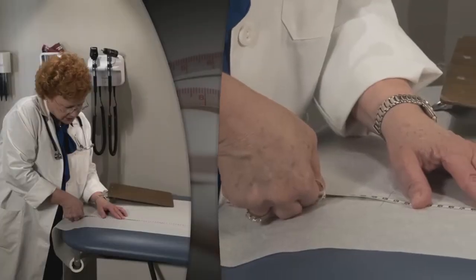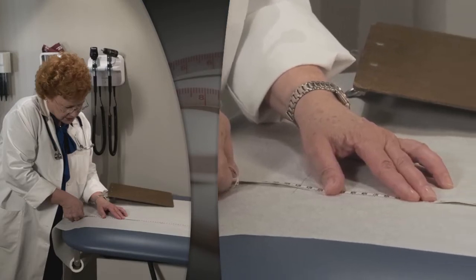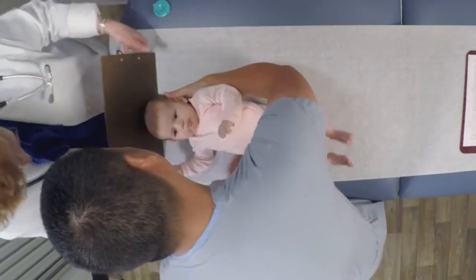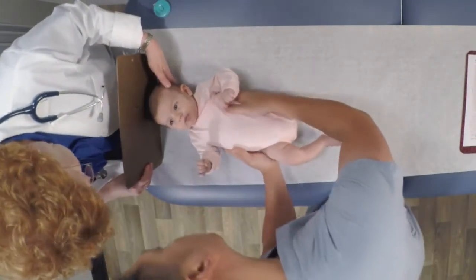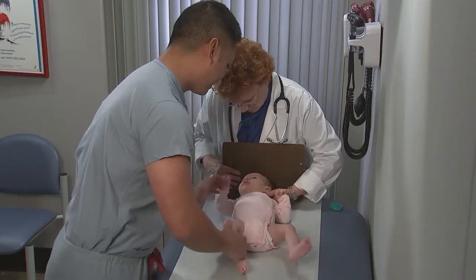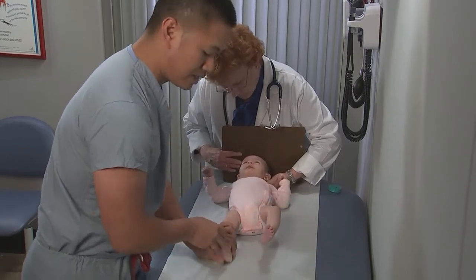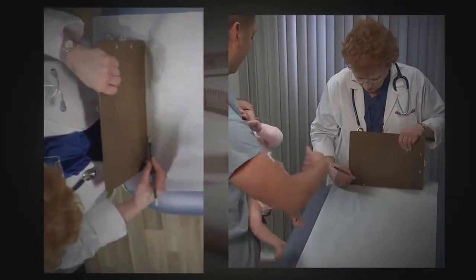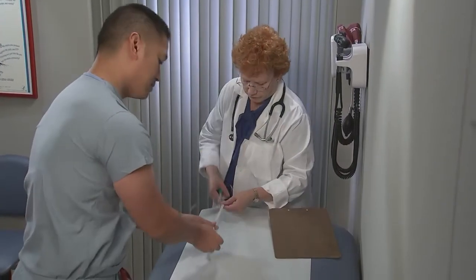If an infantometer is not available, a non-stretchable measuring tape can be used. Positioning the infant's head against a wall or other vertical flat surface is the best way to mark the head position. The infant's legs are then extended as before, the heel position is marked, and the distance from the wall to the infant's heel is measured with the tape.